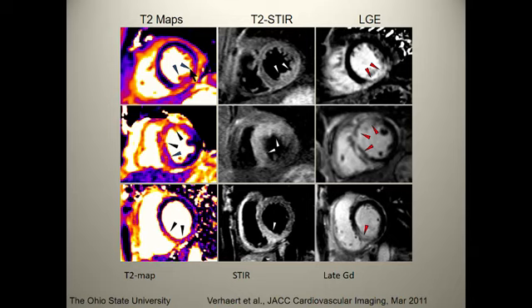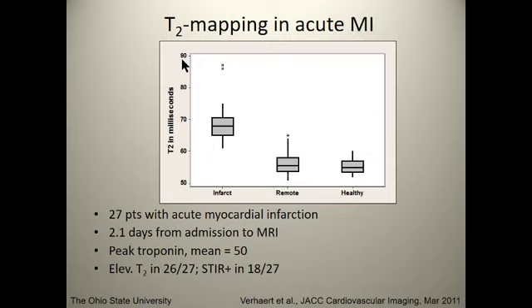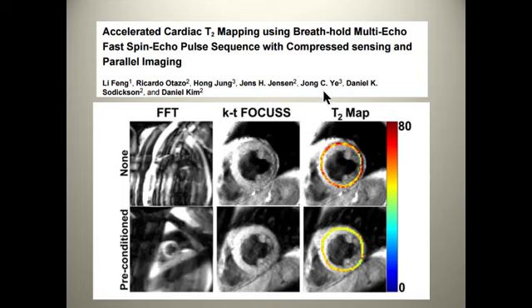The downside of the T2 maps, in a way, in this case, is the image quality isn't that good, and they're quite difficult. So that's sort of a challenge. So, sorry, one more. So yeah, he sees group statistics demonstrating clear signal changes in infarction. And as you'll note, the changes in T2 are actually larger than you get in T1, but the ability to measure T1 is quite high. So it sort of all comes out in the wash. But the changes in R2 are quite large. So, but the limited image quality of the T2 prep method sort of steers us towards other approaches.